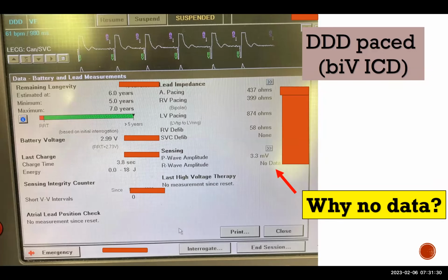So you will see sometimes when we report the pacemaker checks in the office that we'll put NA next to the R wave because we could not find an escape R wave. Does that make sense? Anybody have any questions about that?